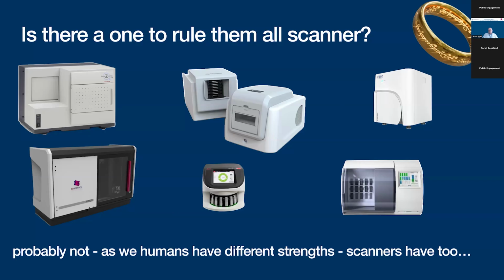We have had the Philips UFS, which is an eminently user-friendly scanner. It is a put-the-slides-in-and-you-go scanner. It's very good, but it has the problem that if any scanning fails, you're snookered, you can't do anything more about it. Our current workhorse, one of them actually, is the GT450 from Leica, which is a very easy and user-friendly scanner, but it has almost no configurability.